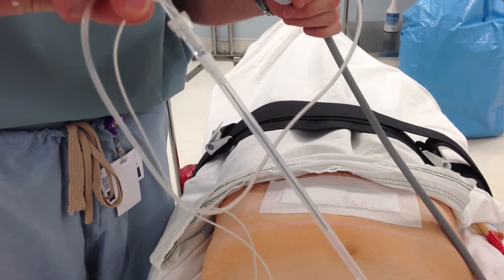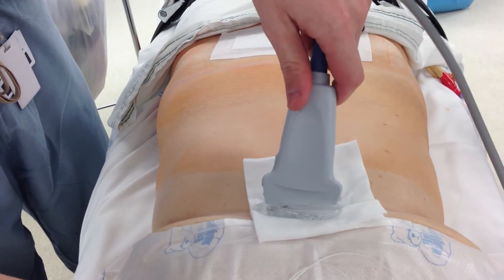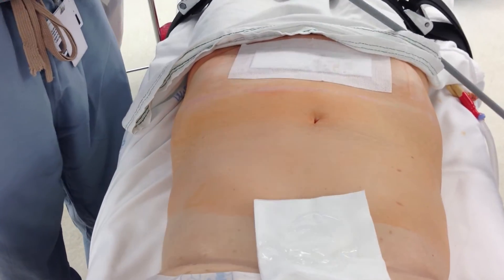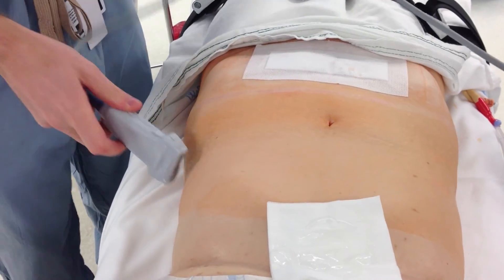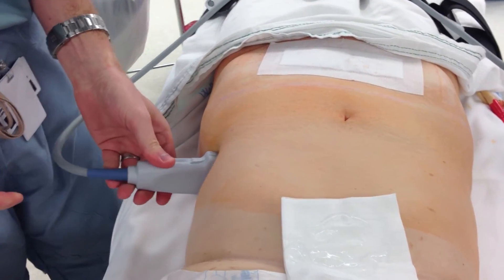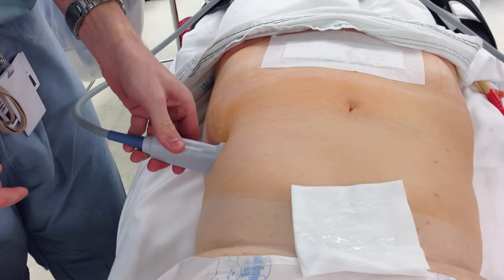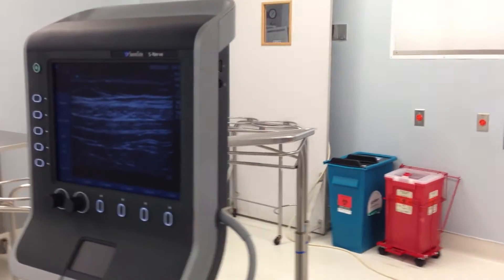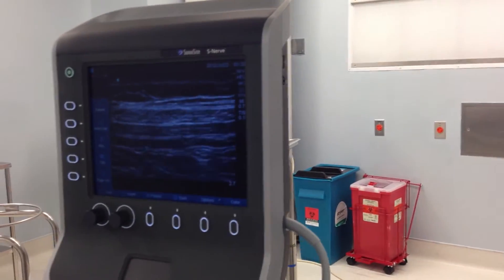This is Exparel that we're going to do a TAP block with, and you can watch on the screen here. So you can see the planes. Do you want me to do the screen also? Yeah, do the screen. I see the plane.